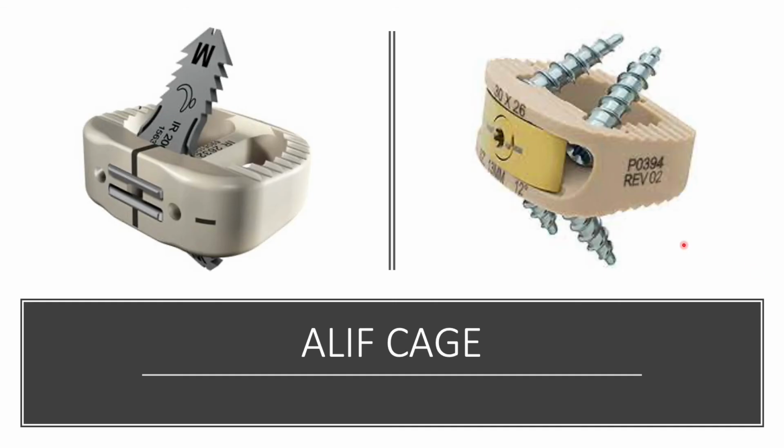Here's a picture of some of the ALIF cages that can be used. It can be a standalone cage with screws going into the vertebra above and below, or even blades going into the vertebra above and below. Because a comprehensive discectomy can be done, the cage size would be bigger and can also dial in various amounts of lordosis, allowing for better deformity correction.